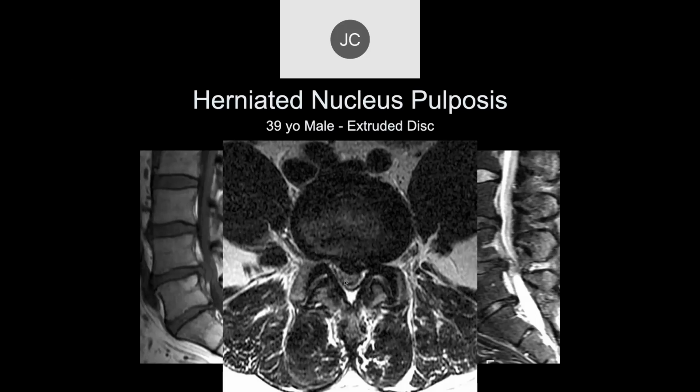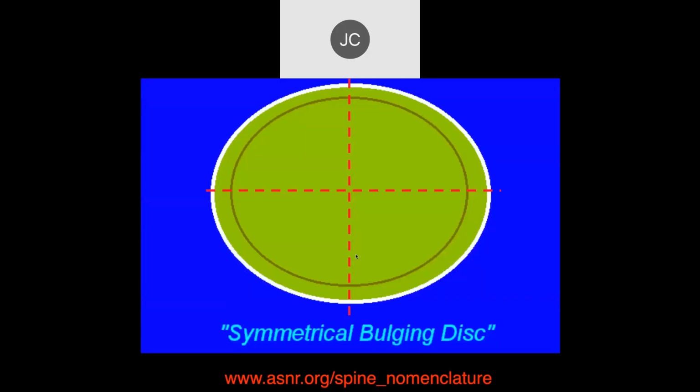And we'll talk about papers that show that if you have an MR scan of the lumbar spine for back pain, and you look at the different MRI findings, there are some findings that tend to portray a very good prognosis and those that are poor prognosis, and we'll come to what those are in a minute. It's not what a lot of people have thought in the past.